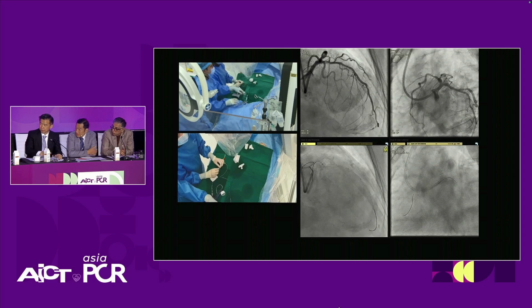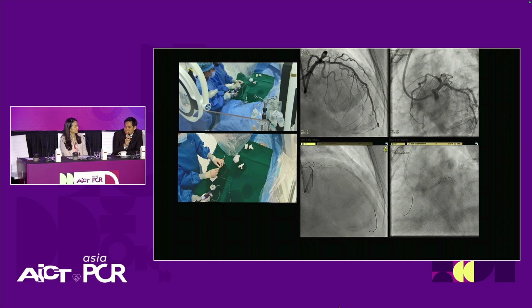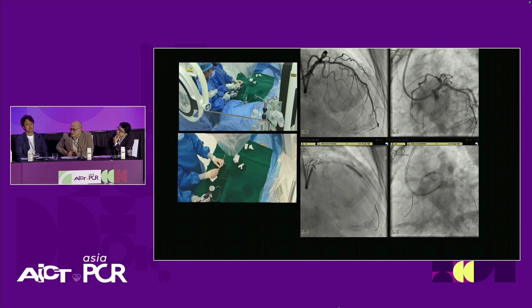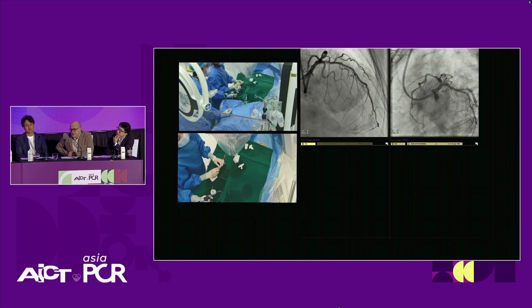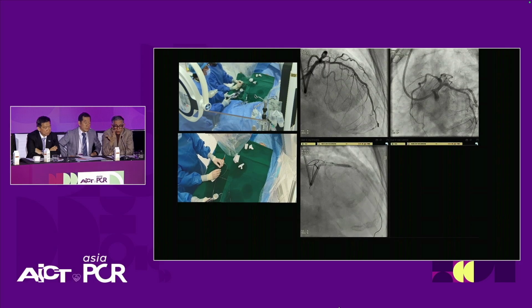I changed my mind. After I see this, I was wrong. I think we did enough. I think 1.75 is enough in this case. Imran, yourself? Probably need to work more in the proximal zones, so I will probably use cutting, and if not, then IVL as well to make it even bigger. Okay. As expected, the effect is modest, so you need to go on to the next device.